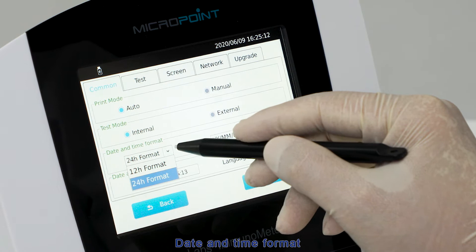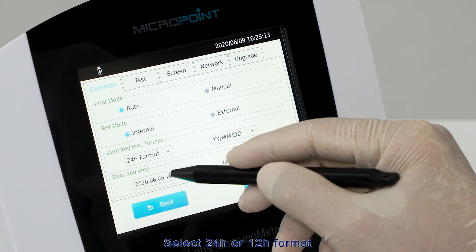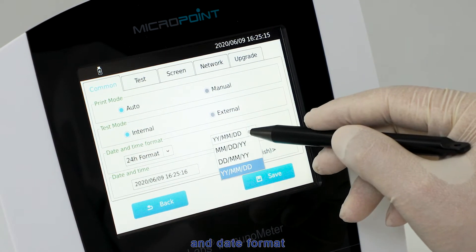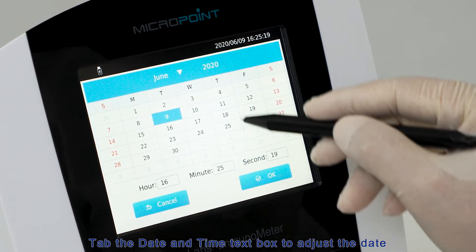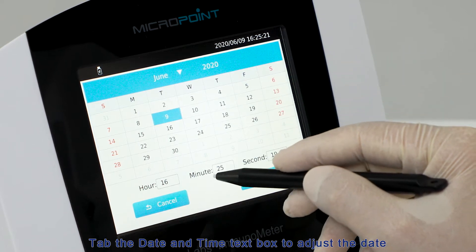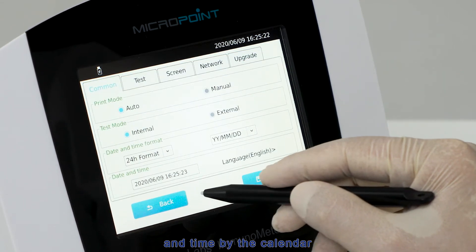For date and time format, select 24-hour or 12-hour format and date format according to your usage habits. Under date and time settings, tap the date and time text box to adjust using the calendar. Tap Back to return to the home menu or tap Save to save your user settings.